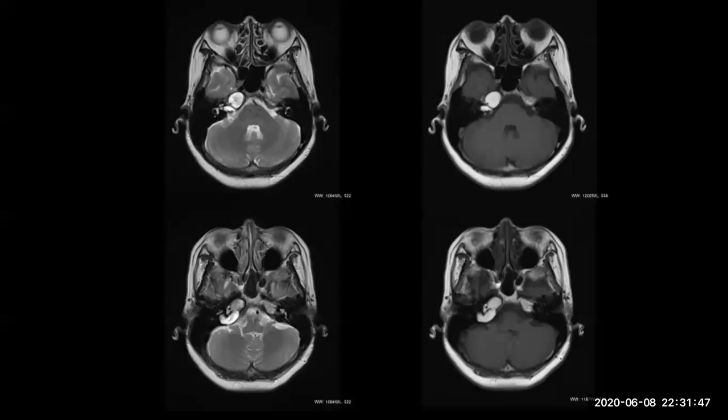We talked about the five points to fill. We do not need a spot diagnosis, and your spot diagnosis is also wrong. We need a description: what is the procedure, what is your finding, the differential diagnosis, our most likely diagnosis, and our recommendation. Okay?